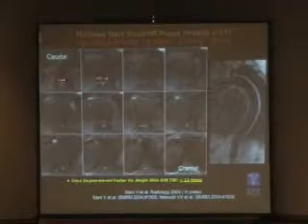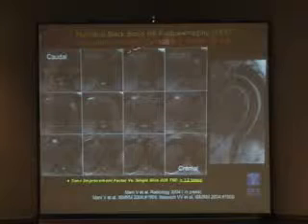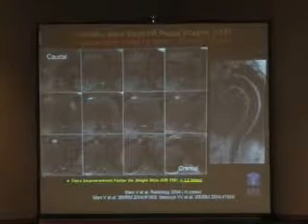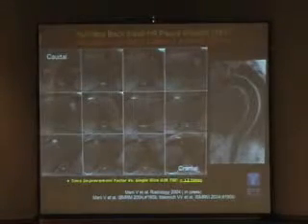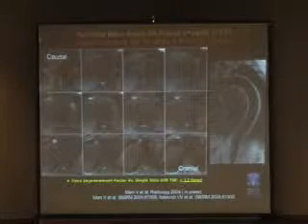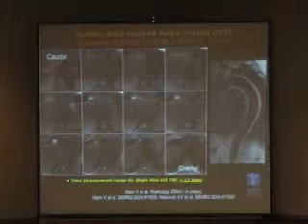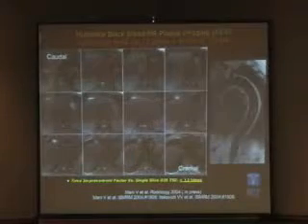And if you want to combine this with cross-sectional images to obtain quantitative volume of plaque, you can obtain 12 slices in less than 3 minutes. So the whole thing can be done in 15 minutes, including the preparation of the patient. You have to look at this very critically and not just brush it off, saying, oh well, it's complicated and it takes a lot of time. Especially with recent advances in imaging, a lot of what you may see in the literature that we or others published 5 years ago, we can now do 10 times faster. It didn't stop there and will not stop there.